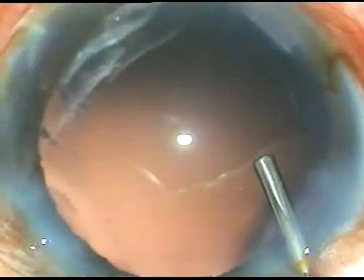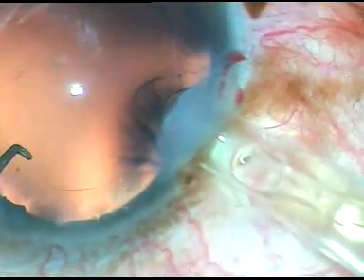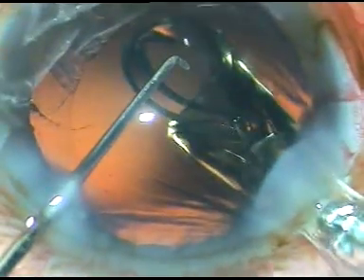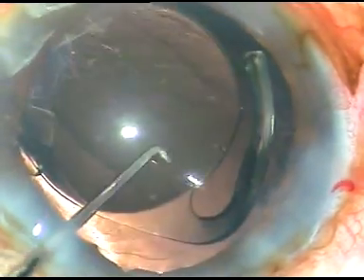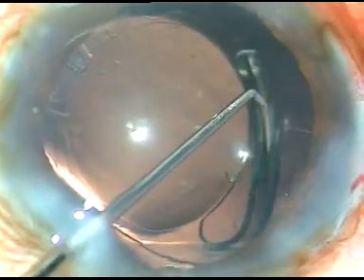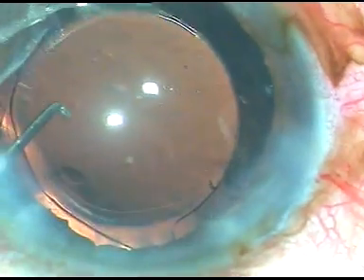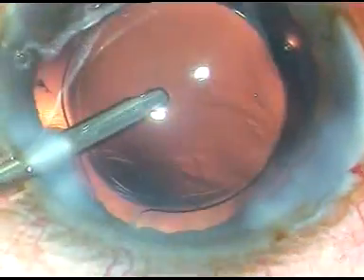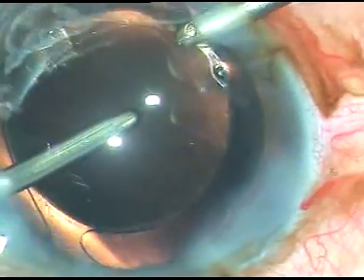I am planning to implant the IOL first now. This is the IOL. This is a hydrophobic aspheric intraocular lens. It goes into the capsular bag. Here it is. It goes into the capsular bag, and now I have to aspirate the viscoelastic substance, and I have planned to remove this vitreous strand.